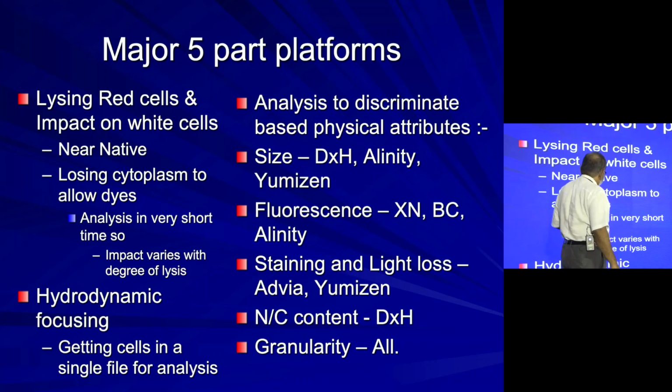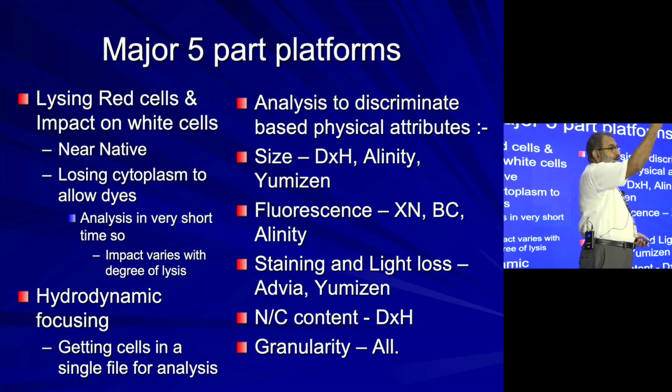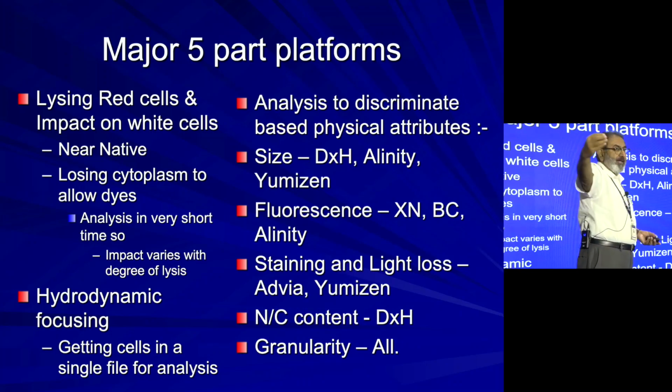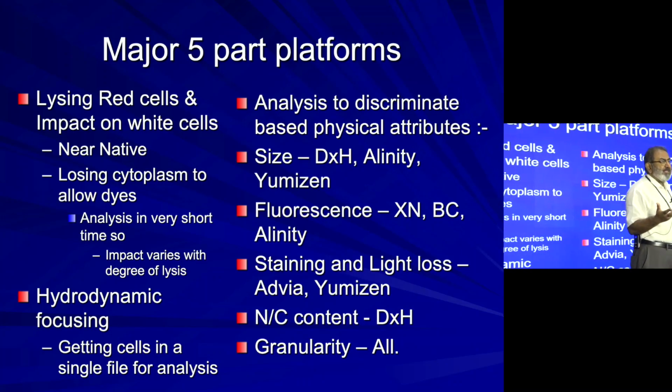So then, of course, how are the cells being analyzed after processing? They go through hydrodynamic focusing, so that they go in one by one, where the analysis is happening by laser. And then what is the analysis that the cell counter does?